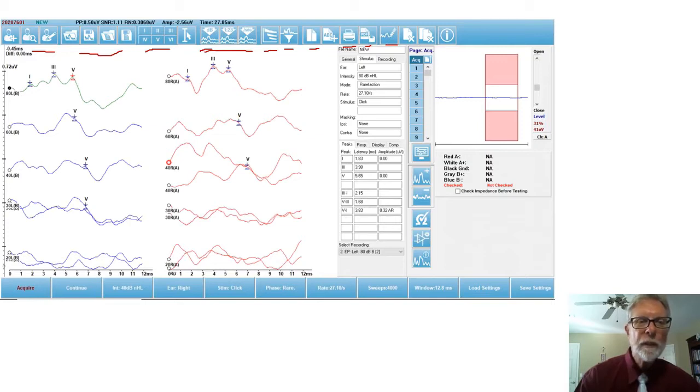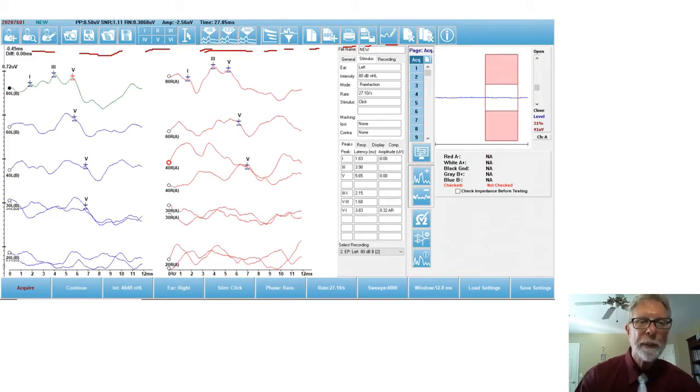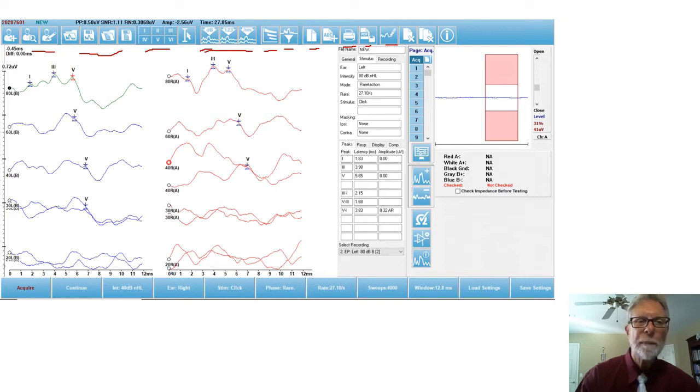Below that, you see the latency graphs for the active wave, which happens to be left ear at 80 dB. You see waves one, three, and five, and their absolute latencies, and then the interwave latencies, one to three, three to five, one to five.